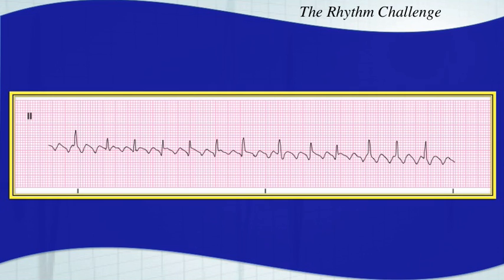Take a good look at the atrial activity here. This is an atrial flutter with variable conduction again. Atrial flutter with variable conduction — your R-to-R intervals are irregular.